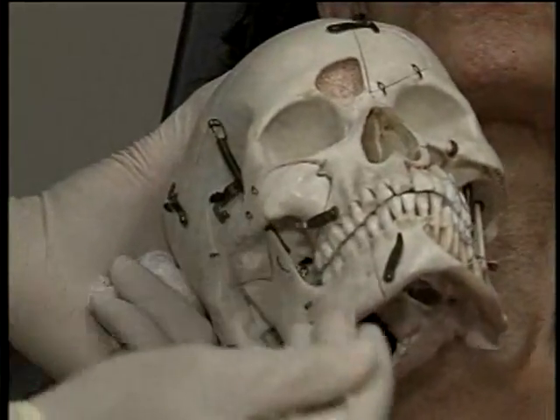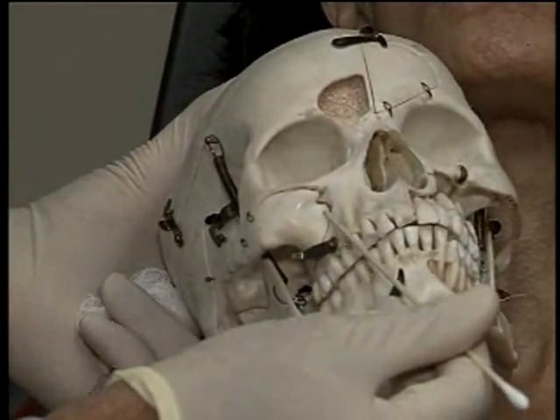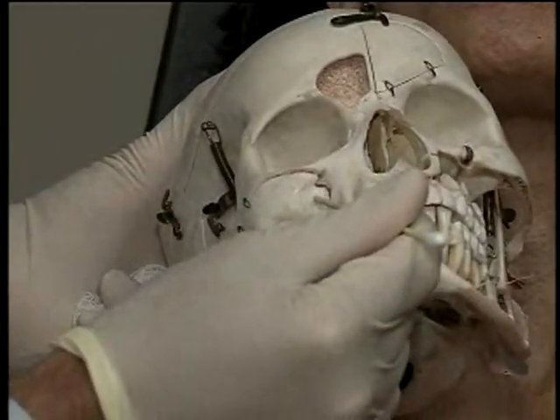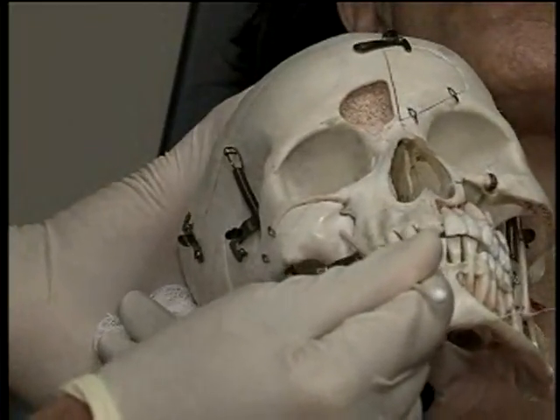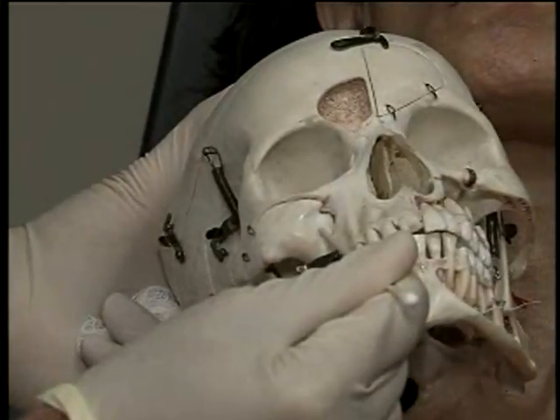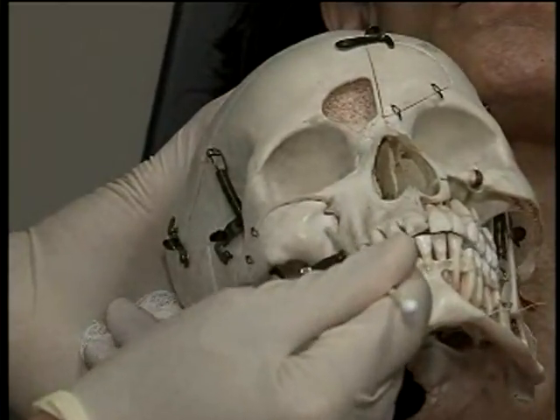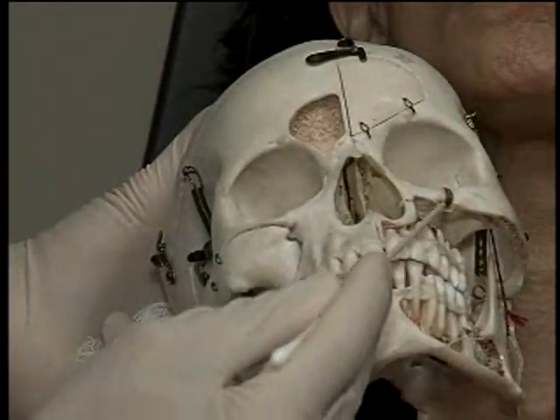Here's looking on the bone. So I go up into the canine fossa, and my preferred technique is to go intraoral, and I'm injecting right about there. My needle touches the periosteum, and I deposit a quarter of a cc, 0.25 cc of Septocaine in that region. So I don't want to inject the foramen, I want to inject right about there, and I'm aiming up infraorbital. Same thing here, infraorbital.